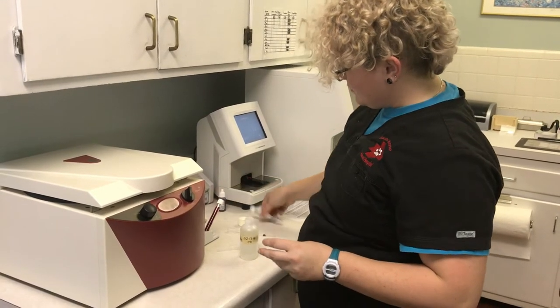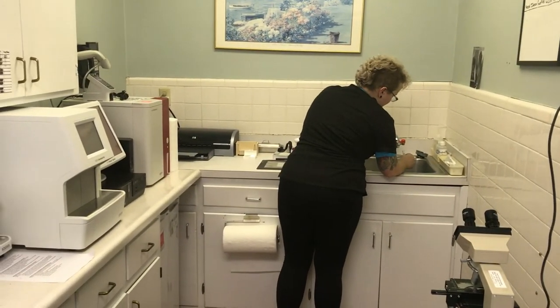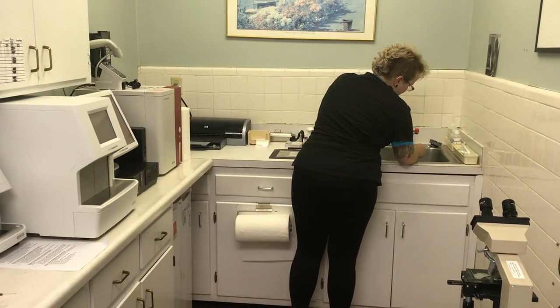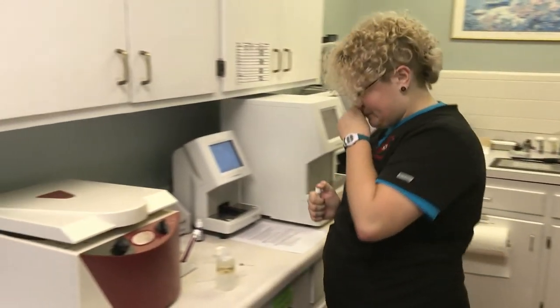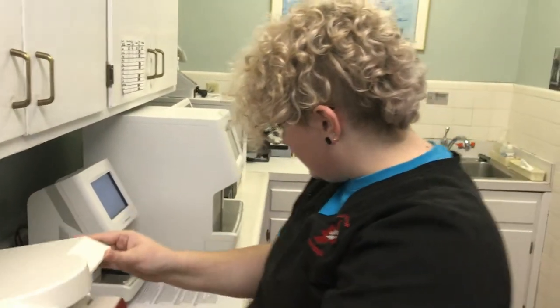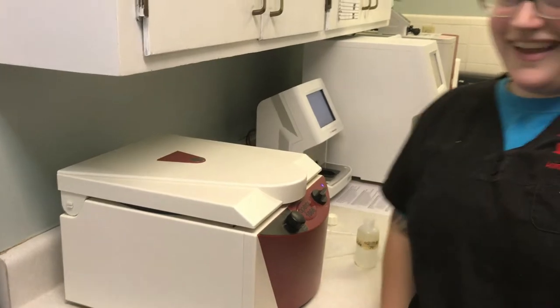Next I'm going to make sure that I get my balance for my centrifuge tube. I'm going to fill up my balance with the same amount of fluid that is in my heartworm tube. I'm going to place my sample into the centrifuge for 5 minutes at either 1000 to 1500 RPM, and then we wait.